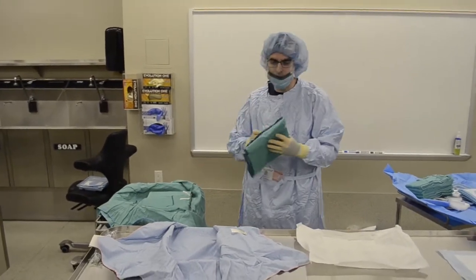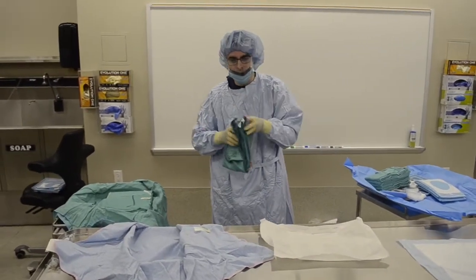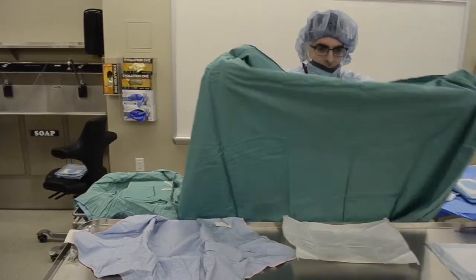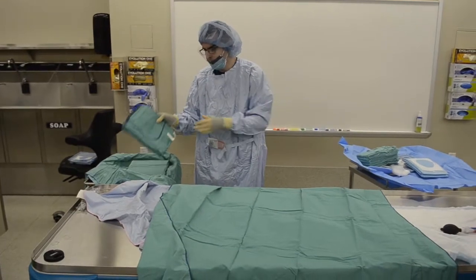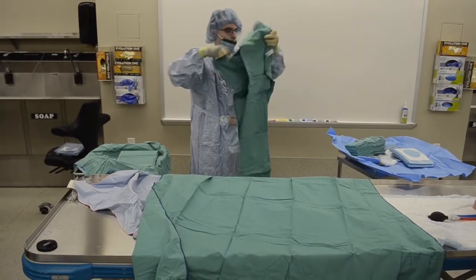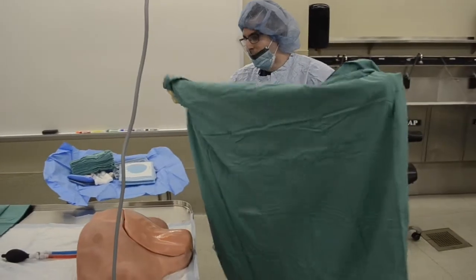So we have 3 size drapes. We have 2 short ones and 1 long one. The head of the patient's up there. The feet are down here. First we use a short one, and I cover up the feet. And you can loop it all the way around. We then have another short one, which we can use to put over the patient's head. Don't forget to put that air mask on so that they have some comfort.